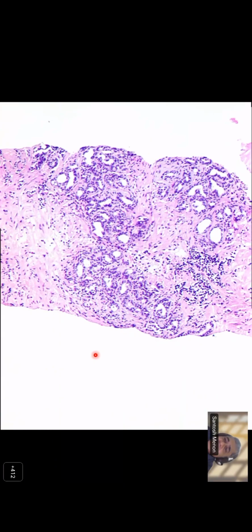Are they the large gland pattern with the luminal convolutions? Are they looking normal? No, sir. No, sir. They are not normal. Everybody agrees to one thing, that they don't look like normal large glands of the prostate. They don't have that foamy or the clear looking cytoplasm of the normal looking glands of the prostate. That is not there. Fine. Yes. So there is some abnormality. You agree to that? Yes, sir. Very good. Yes, please go ahead.